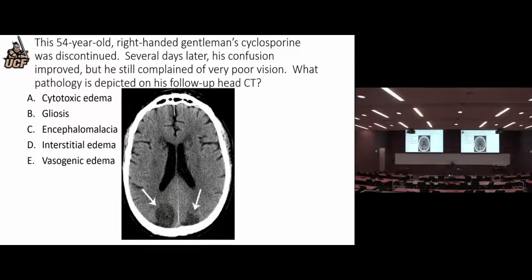So now the cyclosporin was discontinued, confusion improved, but he's now got very poor vision. Now what pathology is on the head CT, follow-up head CT? Okay, got all our responses in. 100% turnout.